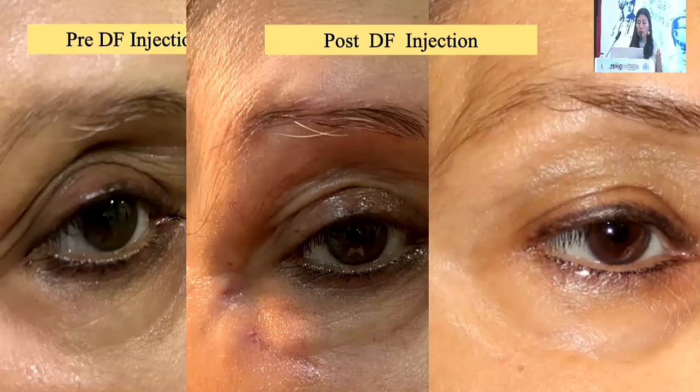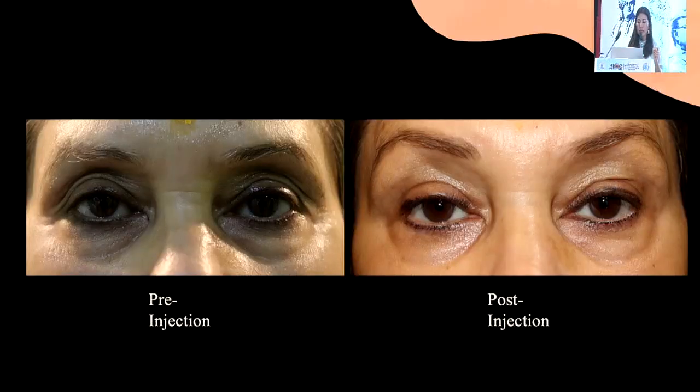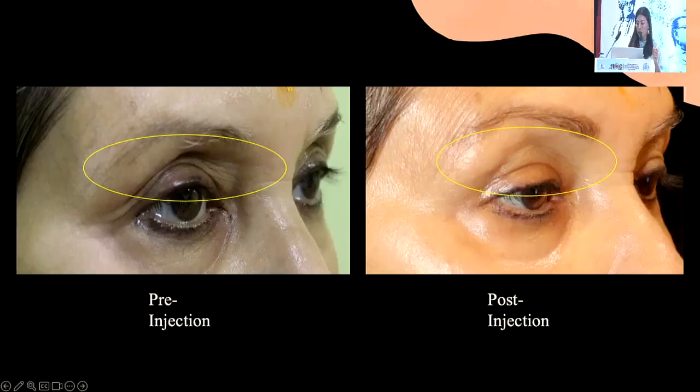This is approximately a week after the injection procedure. So you can see the whole of the superior sulcus got camouflaged with a dermal filler. So these are some of the pre and post-operative patients. This is how she looks, and this is after the injection of the dermal filler.